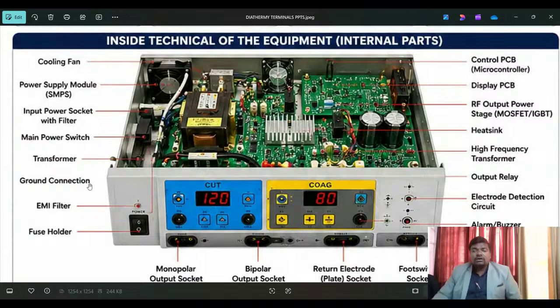Right. So see how many components I am showing you. Every component is not permanent. There is the IC, the main board. By using software and ICs in this medical equipment, it is hardware related, software related, and electric and electronic related. Only with the combination of all these things will it function. If in this equipment, for example, a spare part is not available, then it may not function properly.